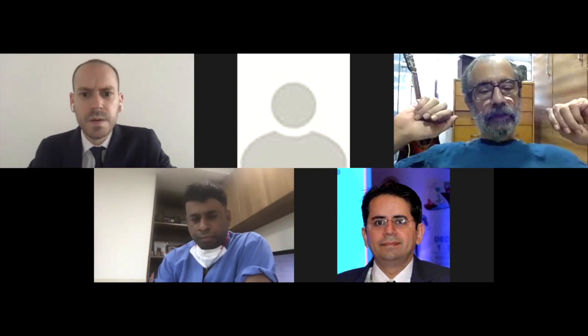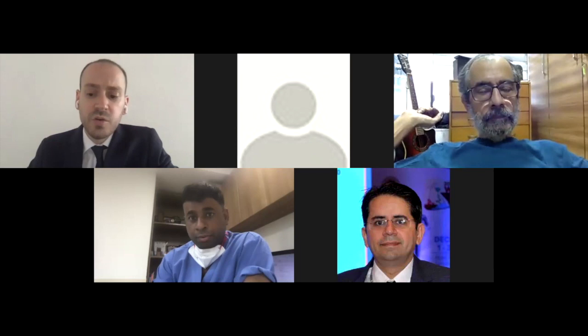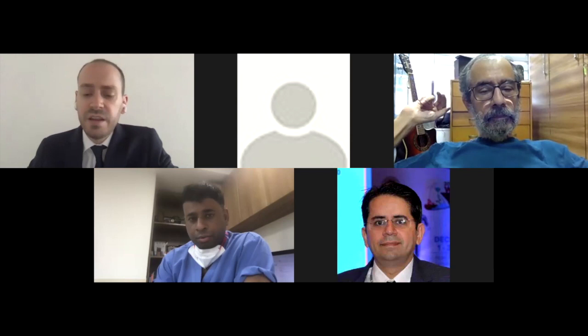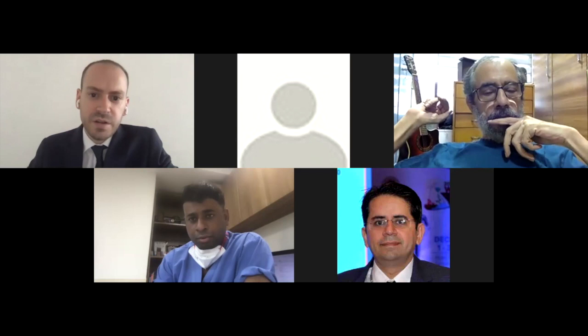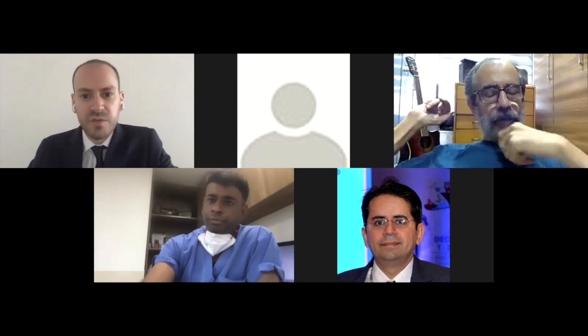Well, you're talking of millimeters. This software, the new machine that we have, actually has an inbuilt calibration. The ideal would be to have a marker close to the knee, and we have a sphere for that, or a coin. It's not ideal because it's not spherical, but we can use a coin as well, as close to the knee as possible. In that case, you would be aiming for the best measurement calibration possible, of course.